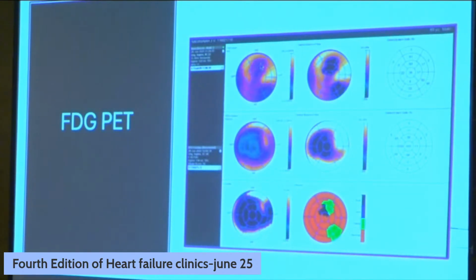That means usually the blue is the perfusion, but here it is becoming red. And here the metabolism has become predominantly blue. That means the metabolism is not there. So only in some small area is the metabolism preserved.